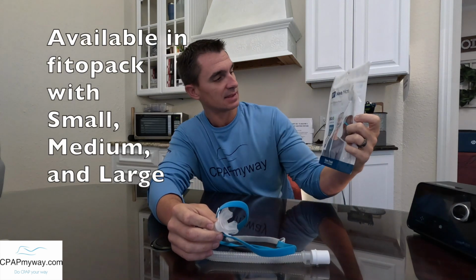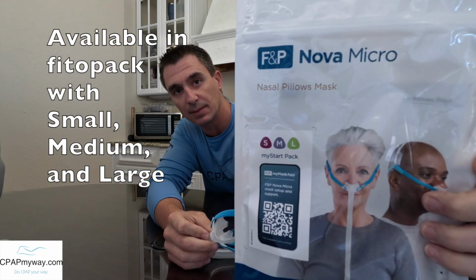But it is available as a fit pack. This particular mask bag I've got here is the small, medium, and large fit pack. This is a medium cushion. If you look on the wing of it over here, you'll notice there's a little M. Obviously, for a small, you'd see an S, or a large, you'd see an L. The medium fit me pretty well. They say if it's leaking, to go up a size.